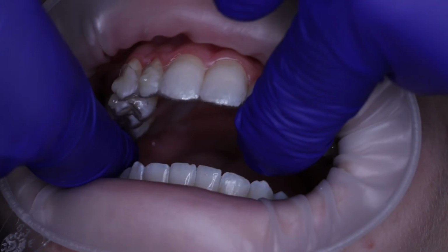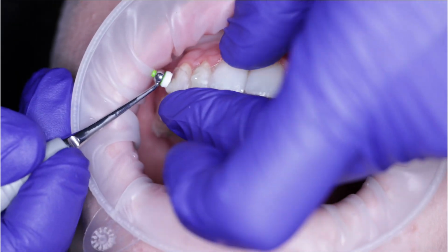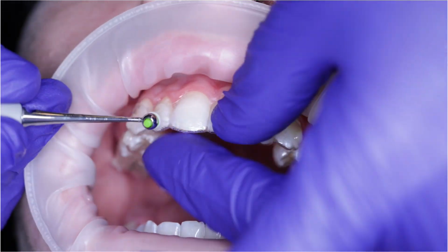Now, the template is very flexible, so you've got to be a little bit aggressive. Again, utilizing that retractor from Ivoclar, the OptraGate, really helps us. We're going to take our instrument, our OptraPad, and we're going to trace the outline of every attachment.